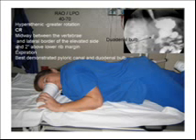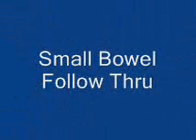For the hypersthenic body habitus, the central ray is 2 inches above the level of L1 and near midline at a 70-degree oblique. The RAO view demonstrates the stomach's pyloric canal and the duodenal bulb in patients with sthenic-type habitus. Peristalsis is more active with a patient in an RAO.